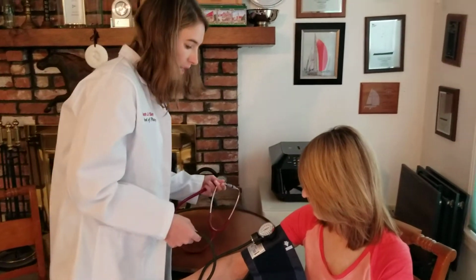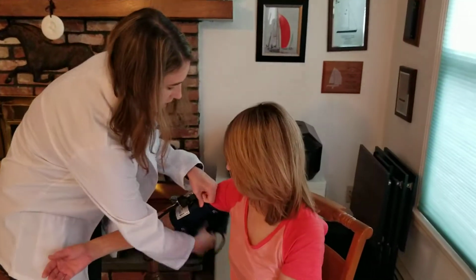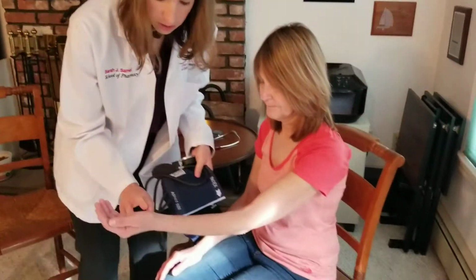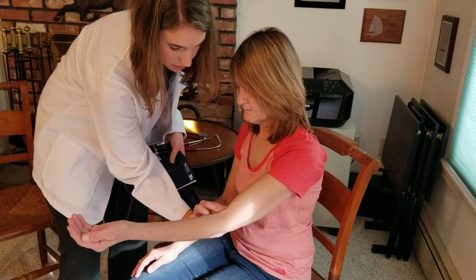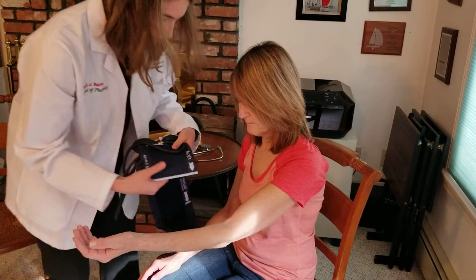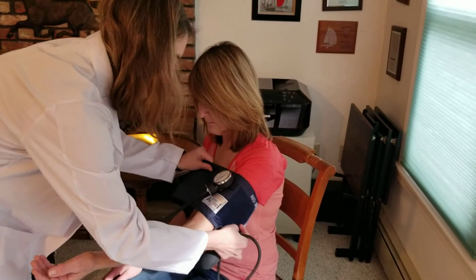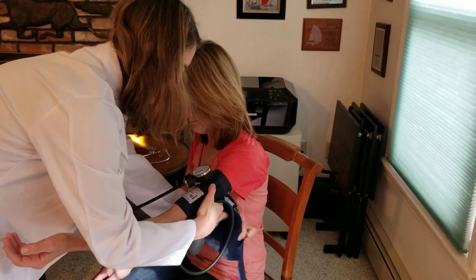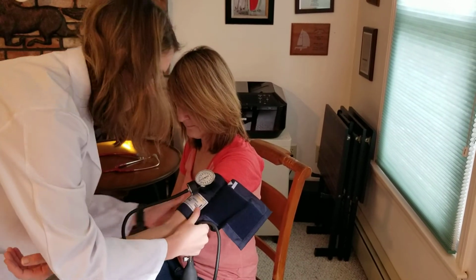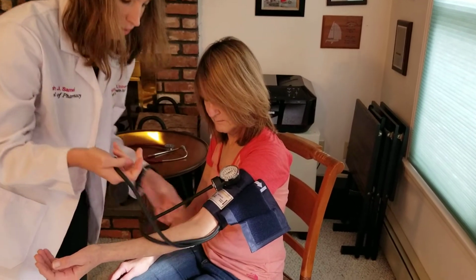So now, just to make sure that I have the right blood pressure, we're going to do the same thing on the other arm. I take that off. Okay, so again, we're going to find the brachial pulse. It's going to be about here. Okay, so that's right there, and then we're going to put, lining it up with the left arm here. And then the bottom of the blood pressure cuff should be about 1 inch above the antecubital crease.